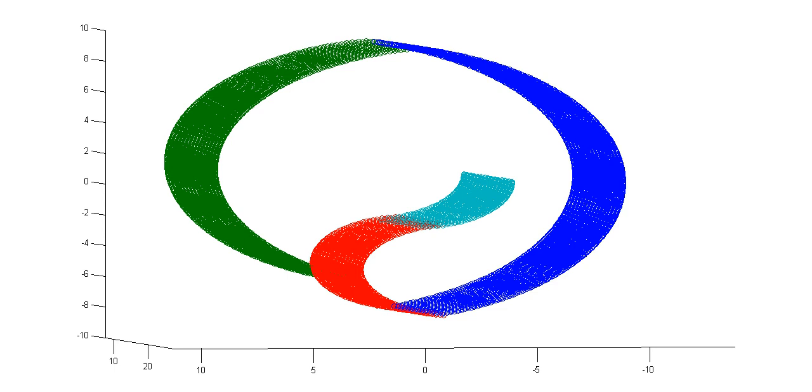So the idea is that you are processing the fMRI data as it's coming in during the experiment and using that to influence the experiment. So, either to try to get people to control part of their neural activity. If you give them feedback saying this part of your brain is becoming active, make it more active or turn it down, even if they don't explicitly know how to do that, they can, through trial and error, figure out ways to control it. To be honest, I don't know what the scientific conclusions of those kinds of studies are. Just that certain brain areas can be controlled more than others, I think, is something that's looked at.